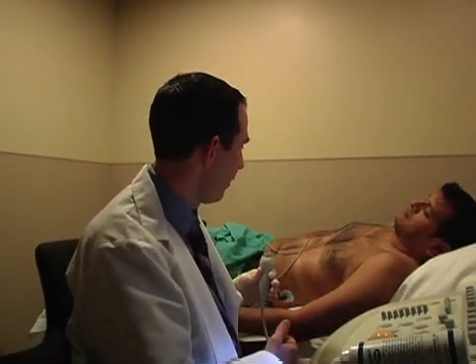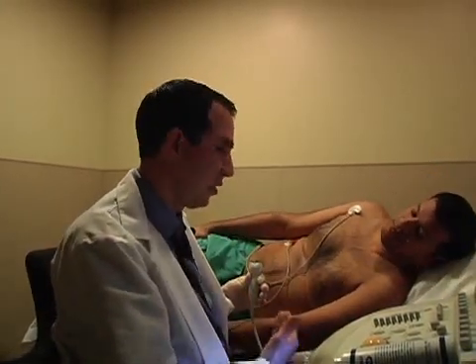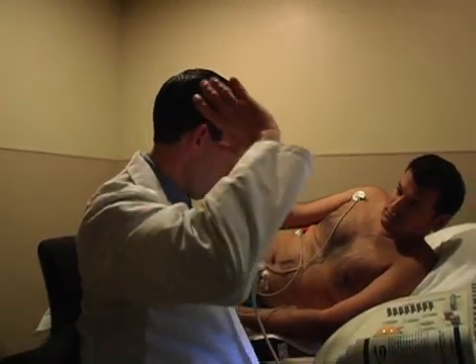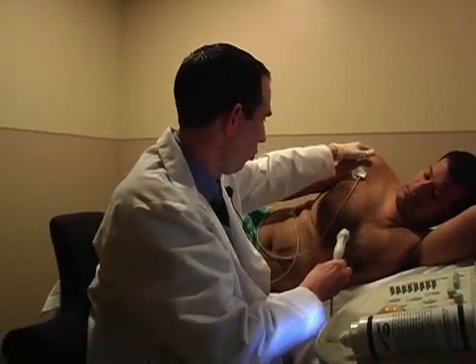I'm going to have you roll over onto your side so you're facing me. If at all possible, you always want to make sure the patient rolls. Obviously, if some inpatients can't roll, then you just do the best job you can. Maybe put your left arm under your head. Sometimes I just grab the shoulder and kind of rotate the patient a little bit.